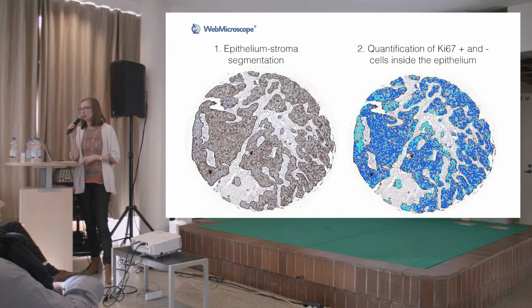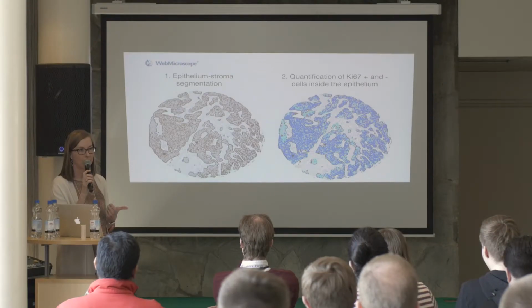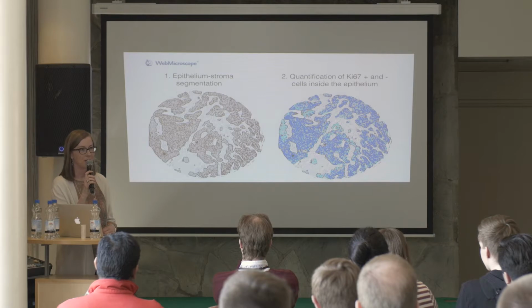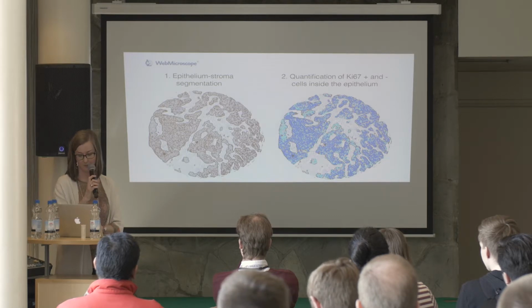And there have been many research studies where it has been shown that the combination of pathologist and deep learning AI is actually improving even the results given by the machine by 85%. So we're really not replacing doctors here. We are supporting them and giving them sort of an artificial second opinion on their shoulder to verify and give them more support to the diagnosis.